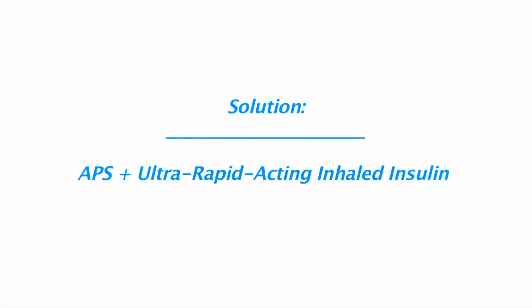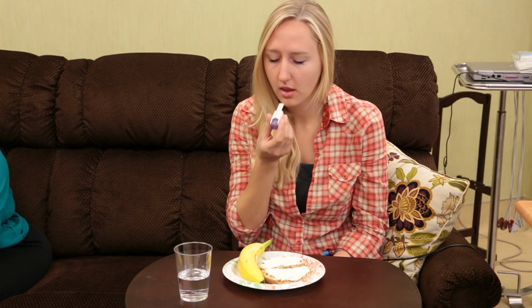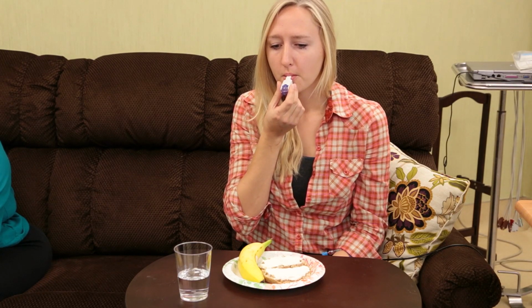In this project that we're doing today, we're also adding inhaled insulin. At the start of the meal, the patient can take a small dose of inhaled insulin. The advantage of the inhaled insulin is it gets in right away, works very quickly. So at the start of a meal, if we can give a small dose of inhaled insulin, instead of the blood sugar going up very fast, it will go up a little bit slower, and the controller and then the subcutaneous insulin can actually work better.